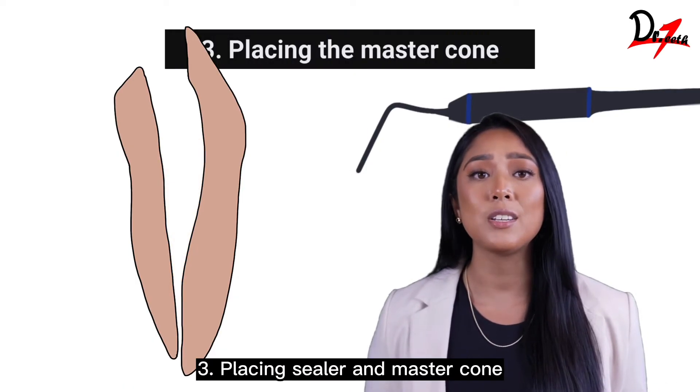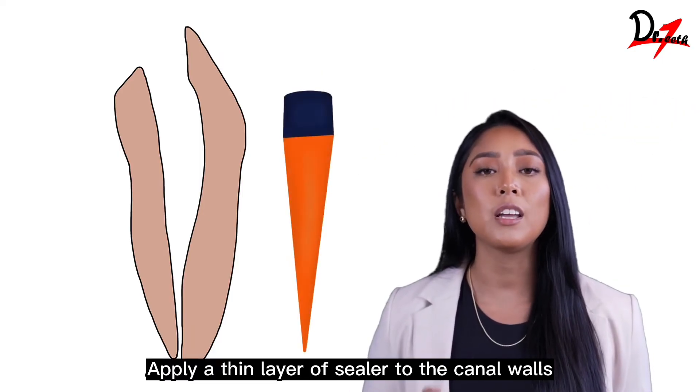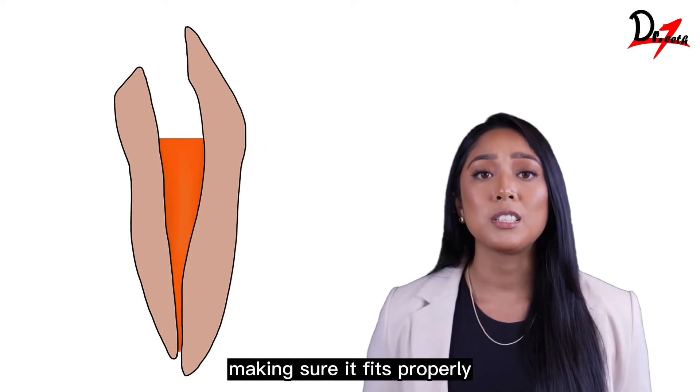Stage 3: Placing sealer and master cone. Apply a thin layer of sealer to the canal walls using the master cone. Gently place the master cone into the canal, making sure it fits properly.